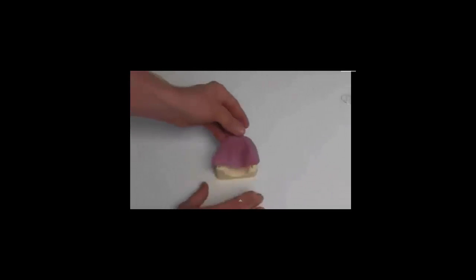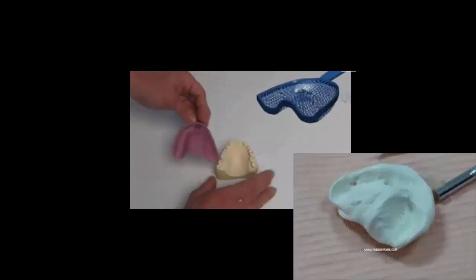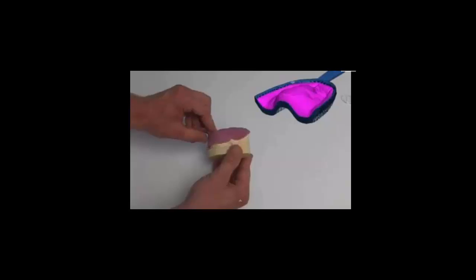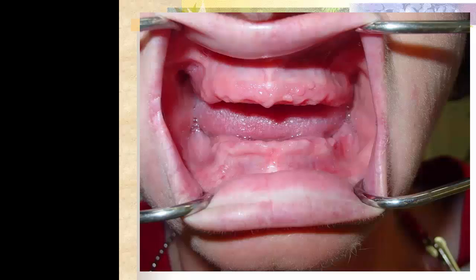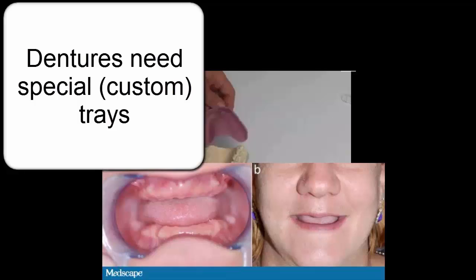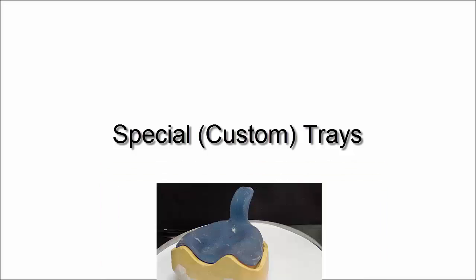With individualized trays, the dental technician produces an individual impression tray customized to your jaw. In order to do this, a pre-impression is initially taken with the prefabricated tray. This provides the technician with a rough overview of your jaw, from which he can produce the individual tray. This is helpful in the case of difficult jaw conditions, such as large or small jaws, or after tumor surgeries, etc.